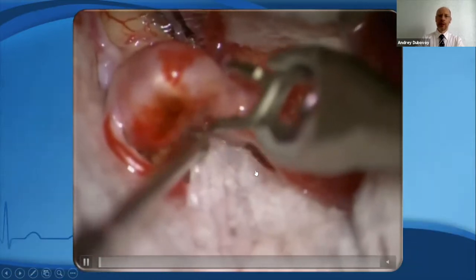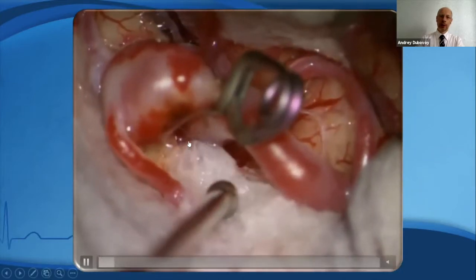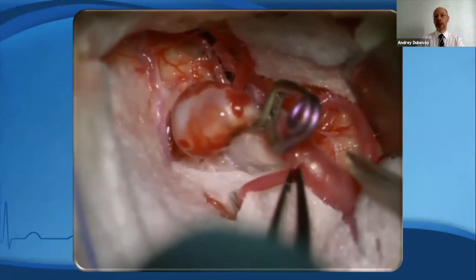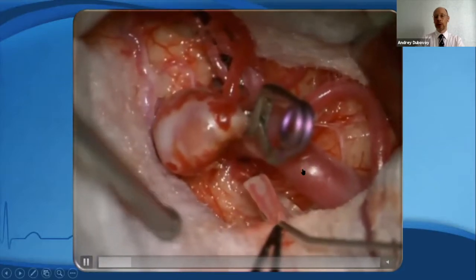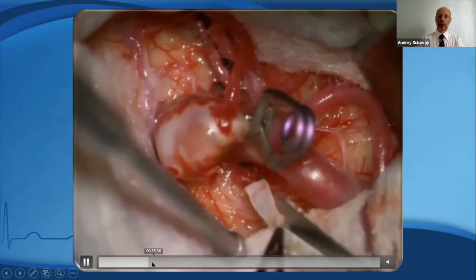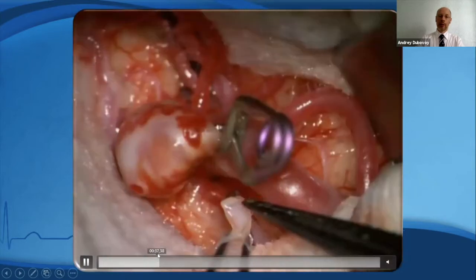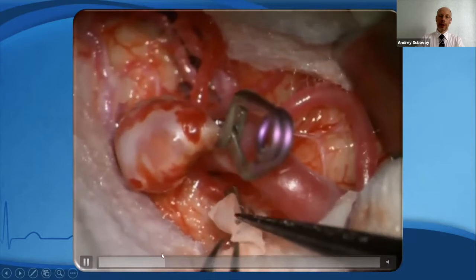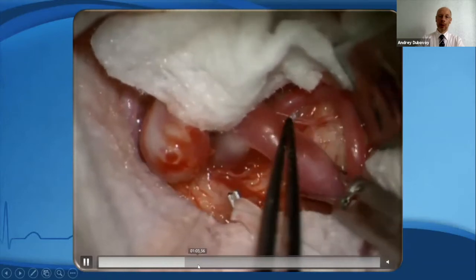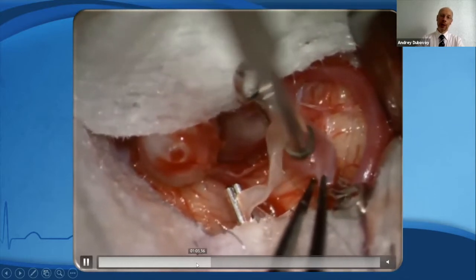In this operation video, first of all, I clip the neck of the aneurysm, preserving the blood flow through the small perforator located near the neck. Then I cut off the anterior temporal artery, choose a good place for suturing to the M1 segment, and flush the lumen of the artery. Then I prepare the end of the anterior temporal artery in fish-mouth fashion, placing my first stitch, then temporary clip the M1 segment. The duration of clipping of M1 in this case was around 18 minutes.